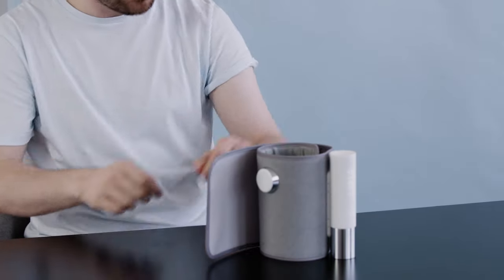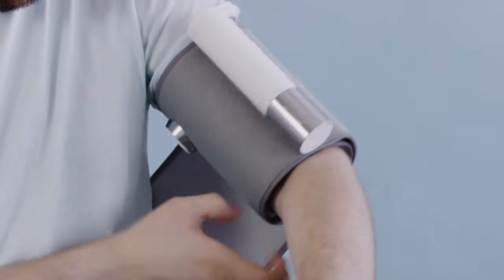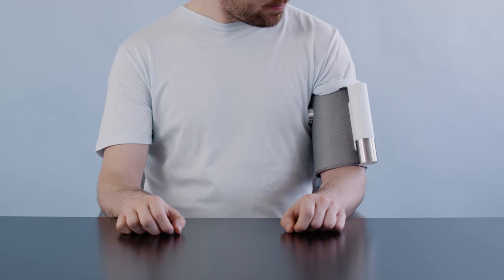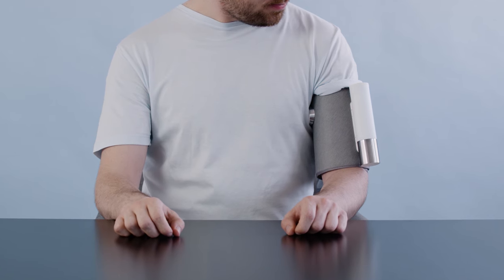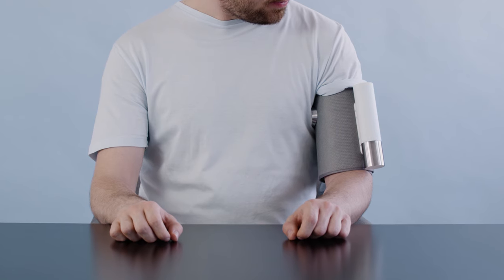Roll up your sleeve and insert your left arm. The cuff should be placed directly on the skin, tube along your inner arm with the button on top. Don't wrap it too tightly — you should be able to insert two fingers between the cuff and your skin.